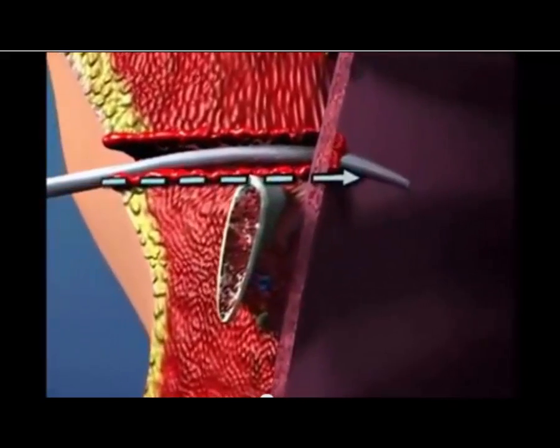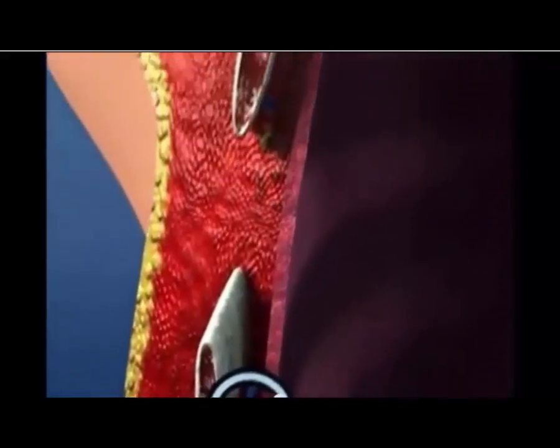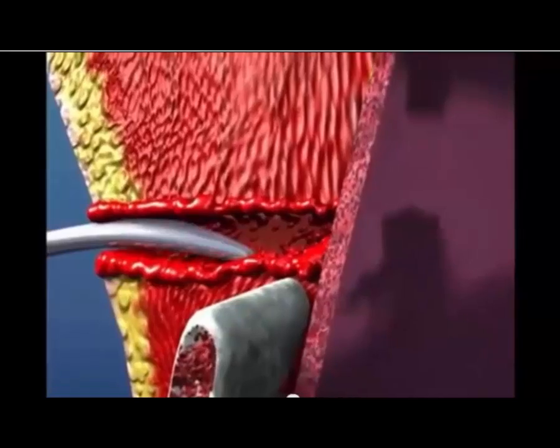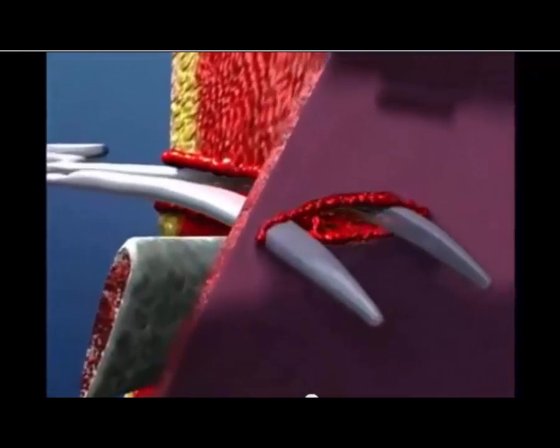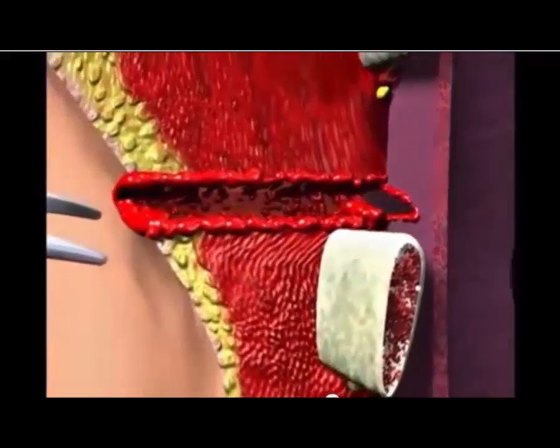You must always enter the pleural space over the top of the rib to avoid damaging the neurovascular bundle that lies along the groove at the inferior border of each rib. Be sure to enter the pleura in a controlled fashion to avoid lacerating the lung with the hemostat. Once inside the pleura, spread the hemostat widely and withdraw it while still open to create a sufficient opening in the pleura for the chest tube.